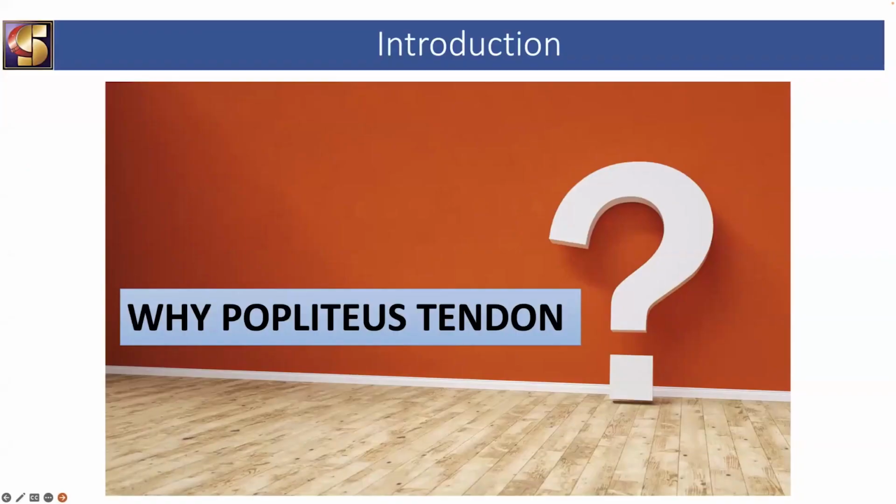So why popliteus tendon? See, it is one of the least evaluated in day-to-day practice. When I selected the topic, I went to the textbook of musculoskeletal ultrasound, but in all the chapters, I couldn't find much about it. So I will try to evaluate as far as possible.